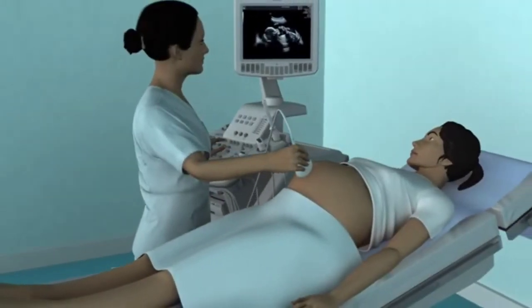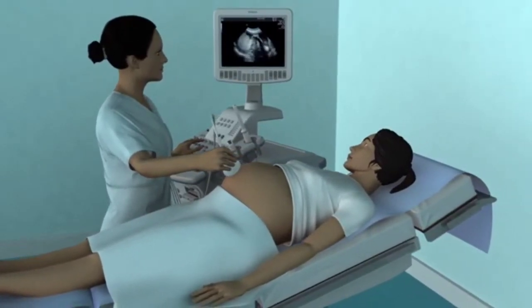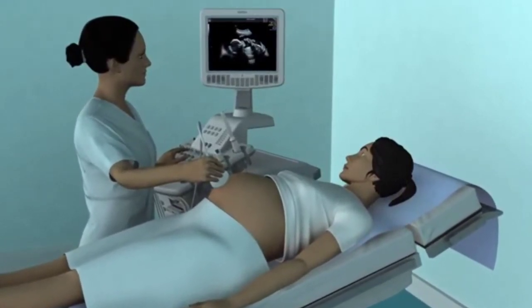Ultrasound imaging uses sound waves to create images of the human body. It is commonly used to visualize fetuses in the womb during pregnancy. This is called obstetric ultrasound.